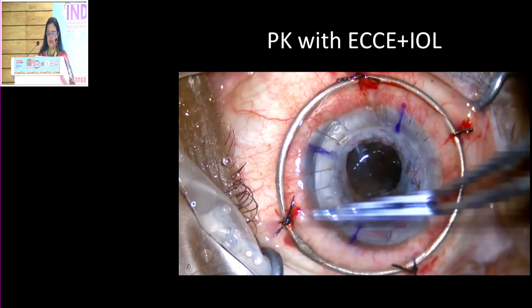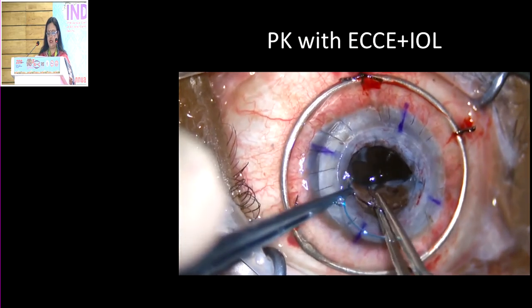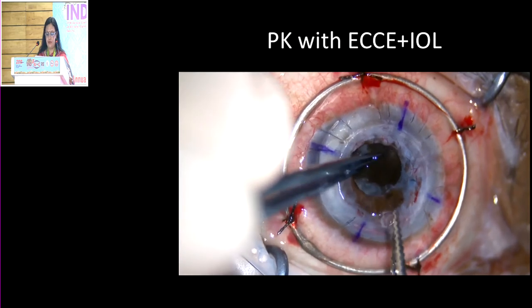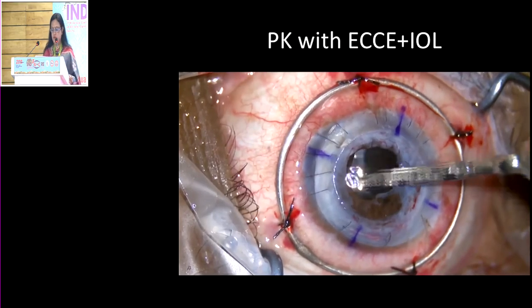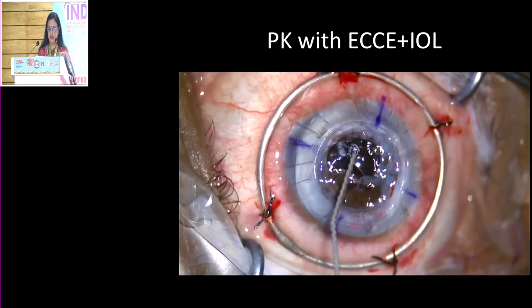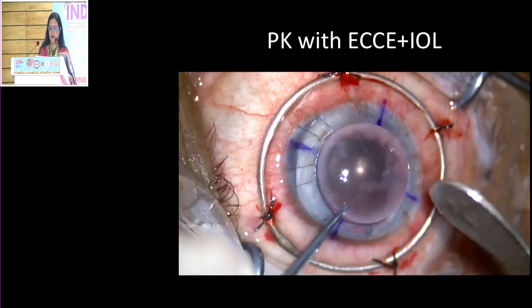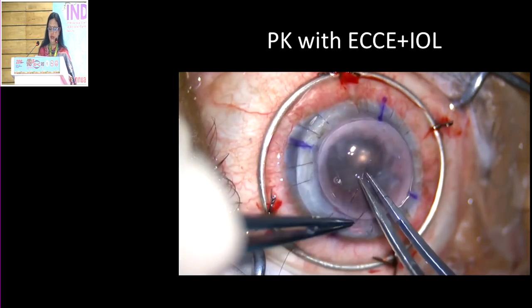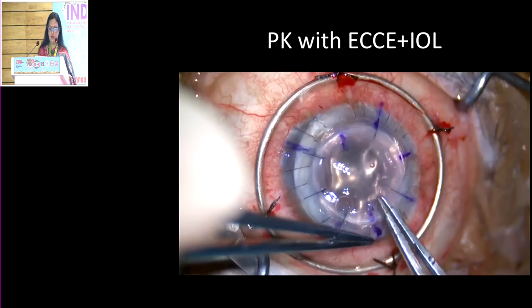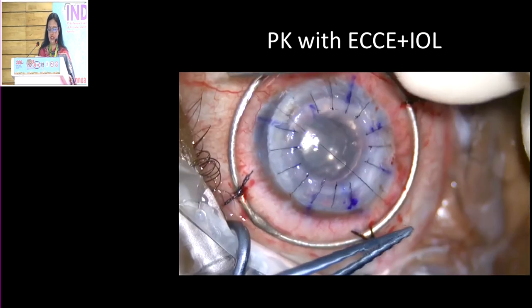Once I've created a large enough space, I'm inserting a multi-piece IOL into the bag. Remove all the cortical remnants because they can induce inflammation, which can actually produce a graft rejection. Not only that, it can produce other complications like postoperative glaucoma. It is very important that after you finish, you evacuate the chamber and remove all the viscoelastic as much as possible.